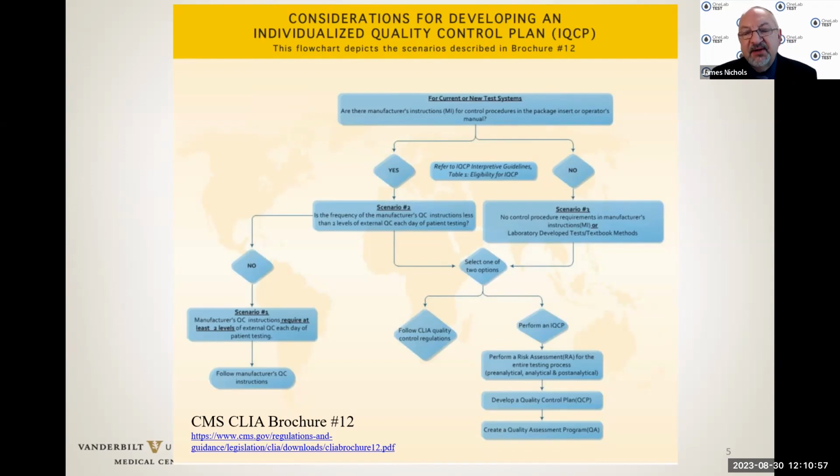If not, heading to the right, you have scenario number 3, where there's no control procedure requirements in the manufacturer's instructions, or it's a laboratory developed test, and you can select one of 2 options. Follow CLIA quality control regulations for 2 controls a day, or perform an IQCP. That has 3 components: a risk assessment, a quality control plan, and a quality assessment program.